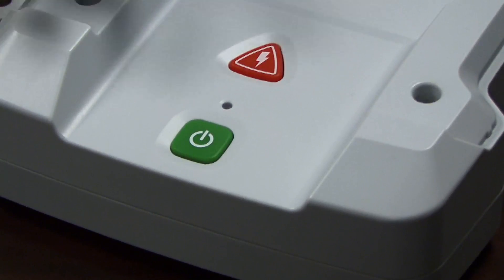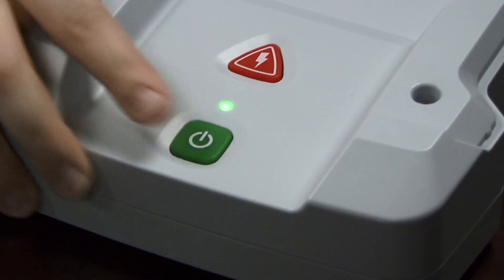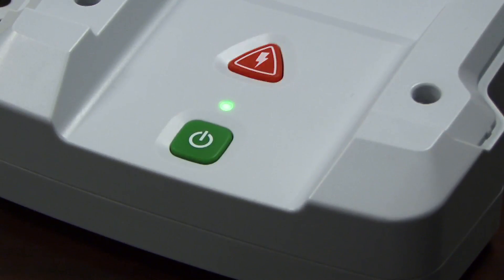To initiate the pad test mode, first hold the green on-off button for five seconds until you hear a single beep. The red shock button will flash.